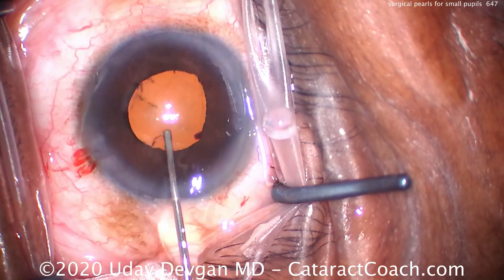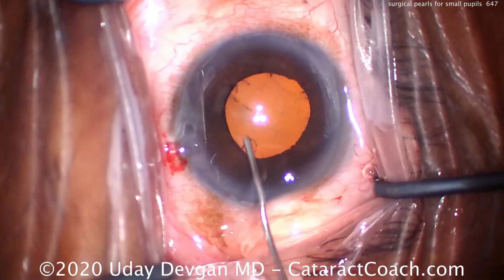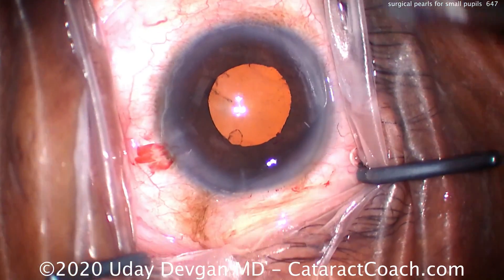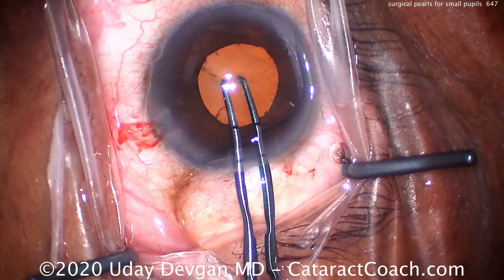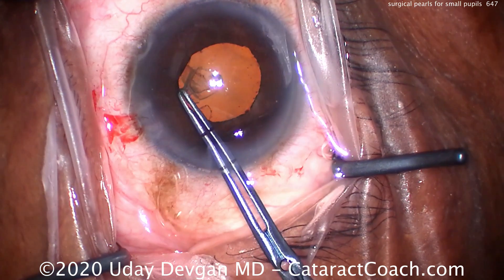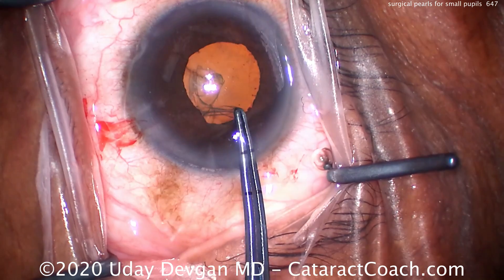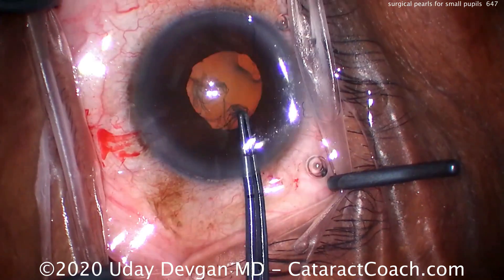Look at this now — the pupil size is pretty good. That looks excellent. So now it's time for our capsularexis. We're going to make this rexis underneath the pupil, underneath that iris margin — larger than the pupil. So here you have about a 4.5mm pupil, but yet we're going to make about a 5mm capsularexis.